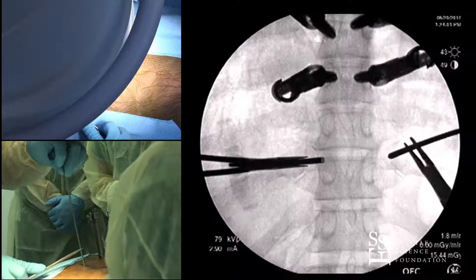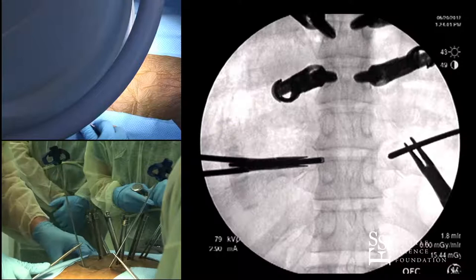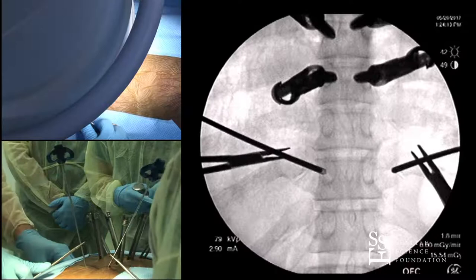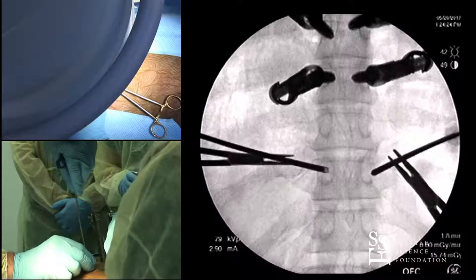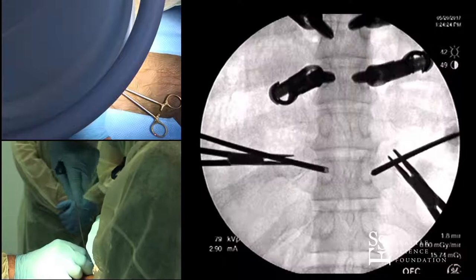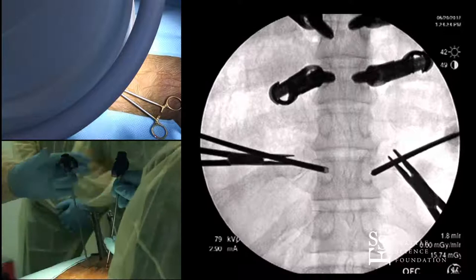I always try to keep my hands out of the radiation as much as possible. I'll go down, touch bone, then take an AP — this gets me in the ballpark and I'll begin to make adjustments. On my side I'm going to try to hit three o'clock, and Andrew's going to hit nine o'clock. Andrew's almost perfect there. If you have navigation, this can be done nicely under some of the navigation systems. So I'm at nine o'clock and I'll start there.